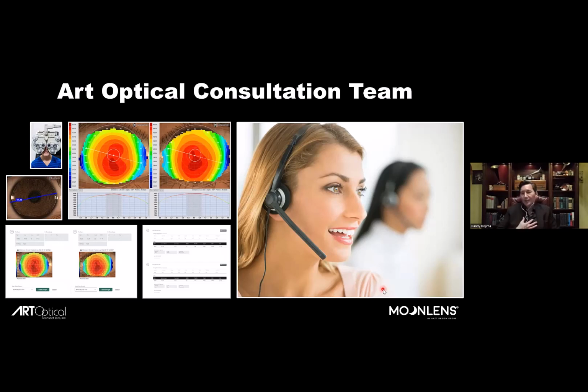Now, I'm not going to suggest to you that you can achieve 97%. Maybe you can. At a controlled site like a Hong Kong Polytechnic, where they have a very rigid protocol for who gets selected for the study, they're going to be a little more selective based on the topography, the RX, and so on.